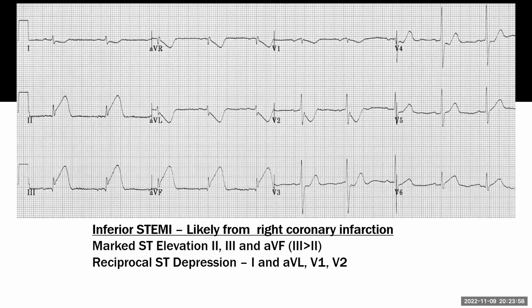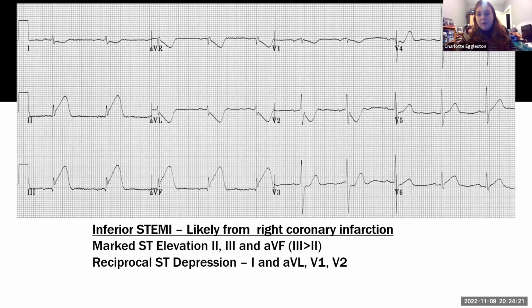May I ask you a question? Of course. So in lead 2, lead 3 and AVF, we can find the ST elevation, while in lead 1, AVL and AVR, there is ST depression, and even a little bit from V2 we do have the depression. Is it the mirror lead? Yeah, so basically mirror. So it's the reciprocal depression. That just means basically they're mirroring.